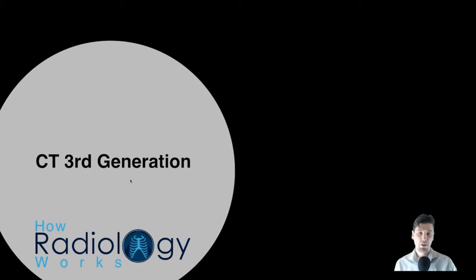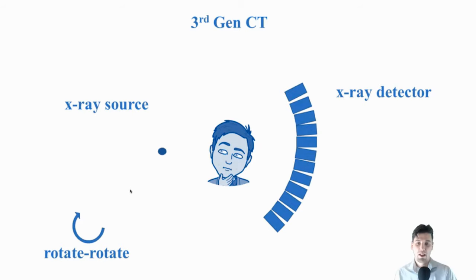New content. In third generation CT, this is really where CT became very clinically useful. And this is a high level schematic of third generation CT. And in comparison with the first two generations of CT, in those two generations, there was a translation that was needed. So every view angle, every time we wanted to acquire a view, we'd have to translate the X-ray source and detector, and then rotate the whole gantry, translate, and then rotate the whole gantry.